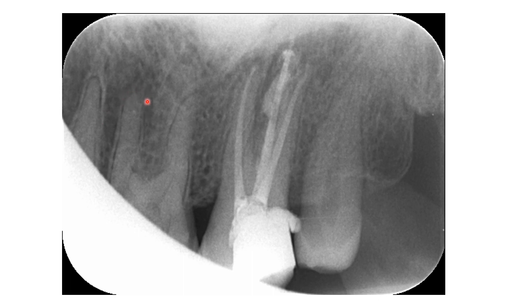The lamina dura is lost here but the PDL — the thing that does not disappear as I said — is still traceable. Again for the mesiobuccal, then go to the palatal from here and follow up. This filling is over-extended — this is the apex and this is the over-extension of the filling.